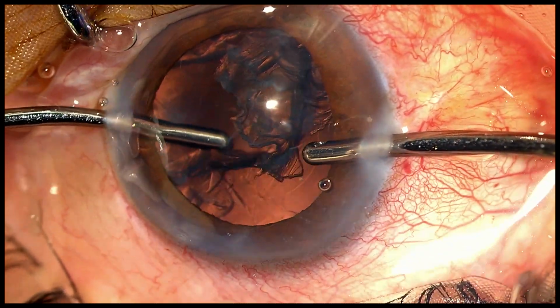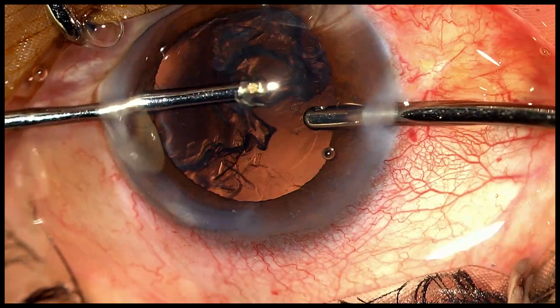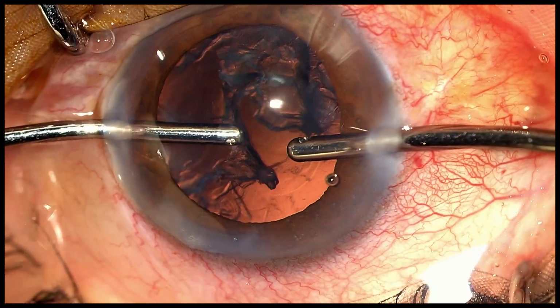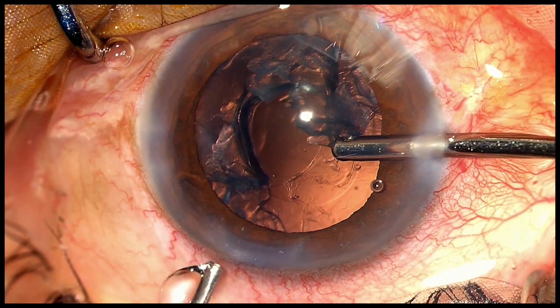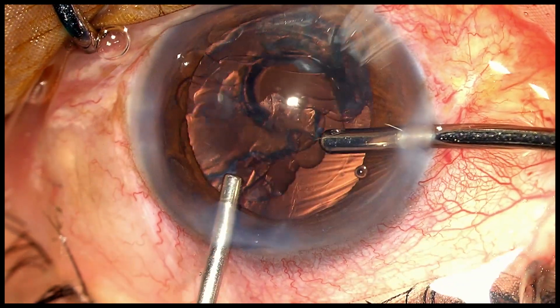As I proceed with the aspiration of the epinucleus, I can notice that the underlying tear seems to be enlarging. So I remove the aspiration cannula and perform a viscofluid exchange to prevent any vitreous herniation.